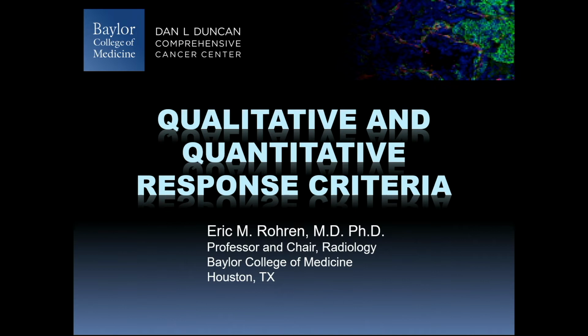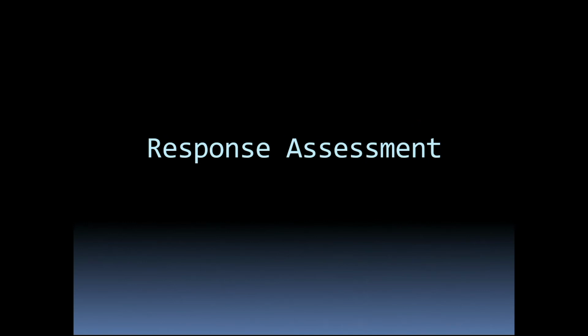Frequently they'll call and say, I read your report, but do you think the tumor is getting better? Is it worse? They need to decide what to do with their patients. But there are some schema out there, and particularly for clinical trials, as we validate new drugs and look at new therapies, there are some regimented ways of doing response assessment as well. And so I will address some of those and show you a little bit of data that goes along with that.